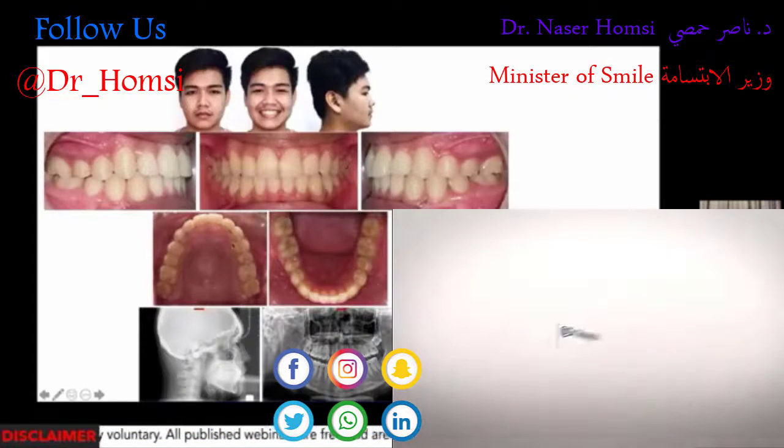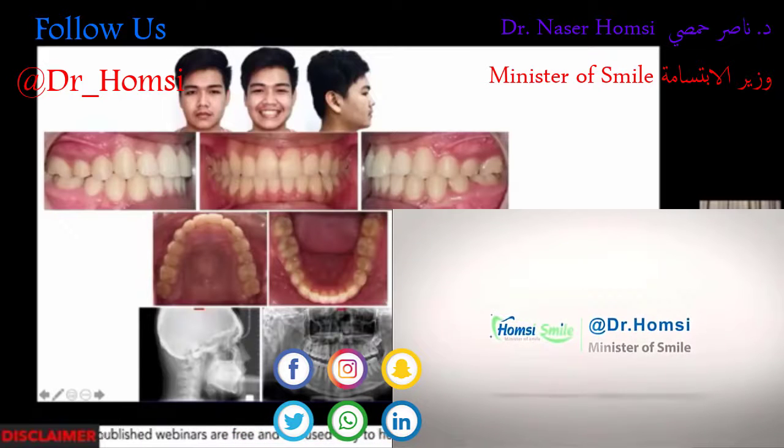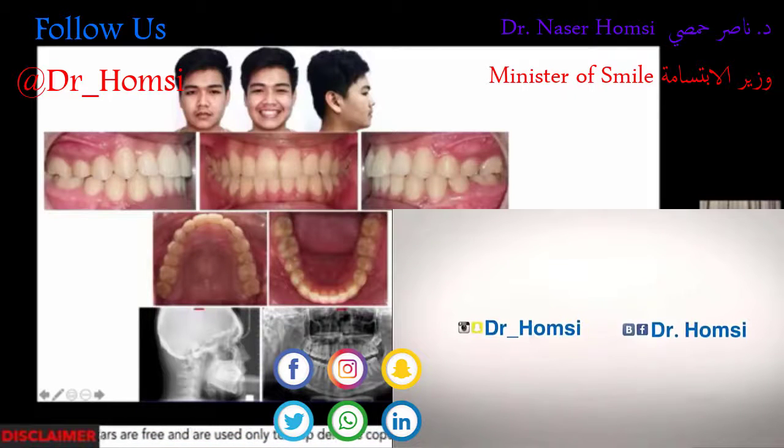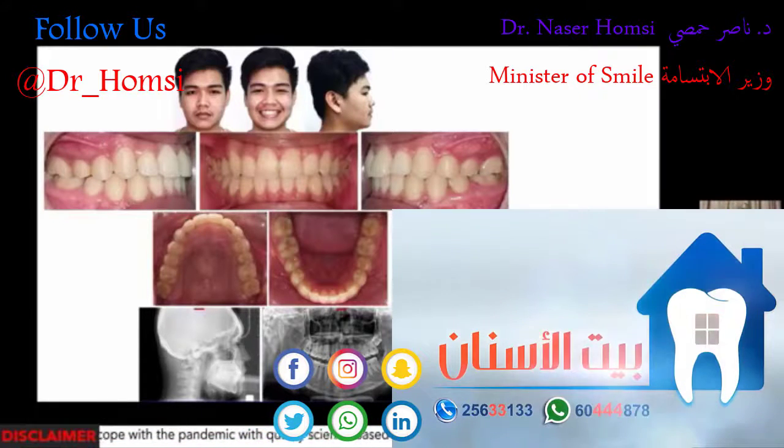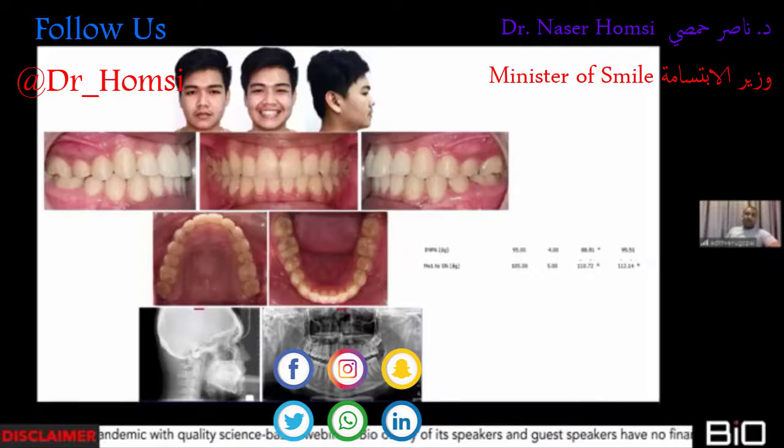But you can see the change in the IMPA. I changed the IMPA from 88 degrees to 95 degrees. That's about 7 degrees. And again, according to the paper from Matsumoto, he is going to lose his gums probably pretty soon. That's about a 50% chance of him having dehiscence on the incisor area, lower incisor area especially. You can also clearly see that the upper incisors are proclined, but not too much, just by 2 degrees.